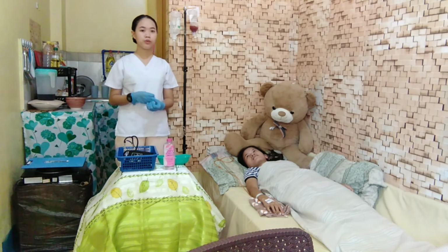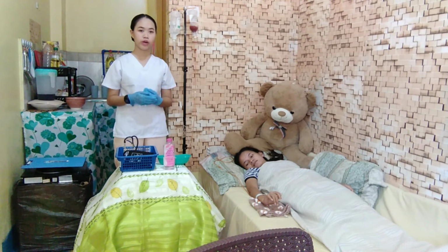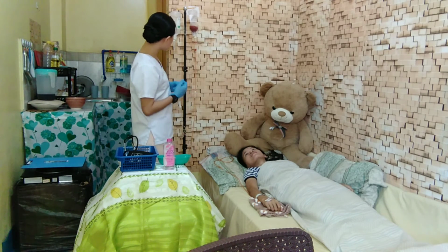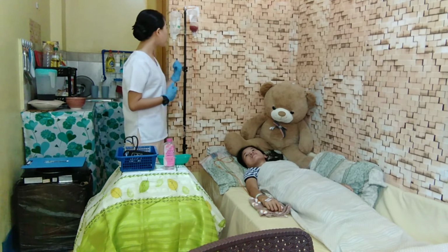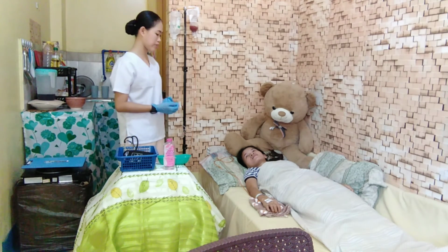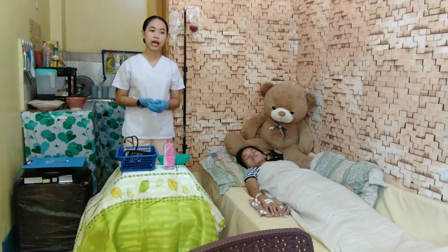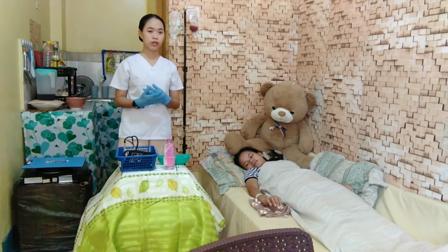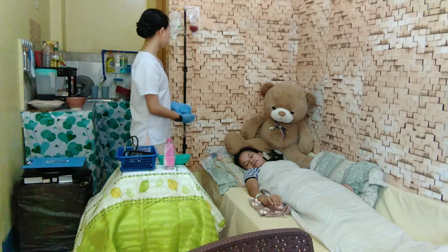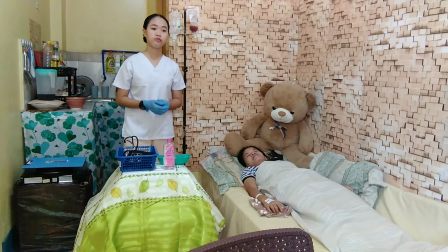We will now administer the 0.9% NaCl before and after the blood transfusion. As you can see, we will administer the 0.9%. Before, she was already given 0.9% normal saline, and after, we will administer it again. Administer the blood for 4 hours only. As you can see, we have transfused the blood to the patient for almost 4 hours.